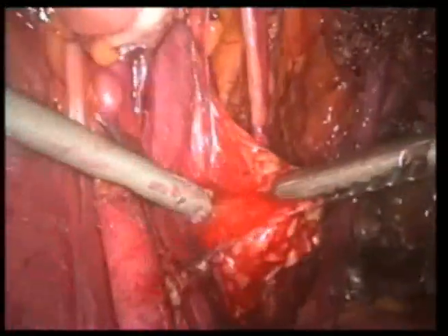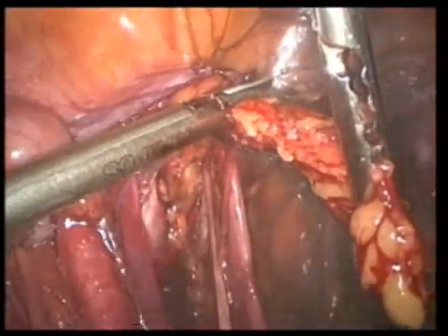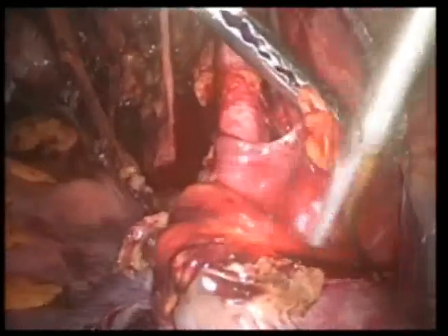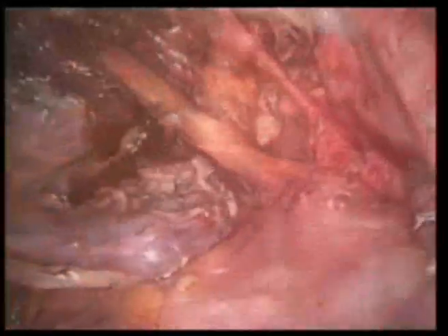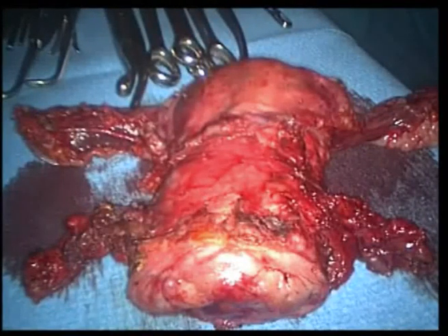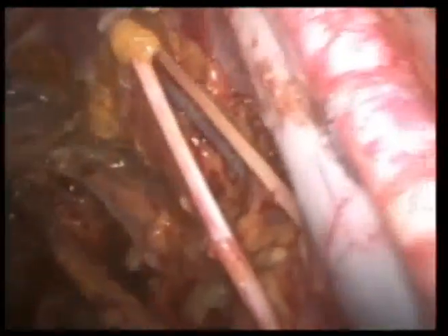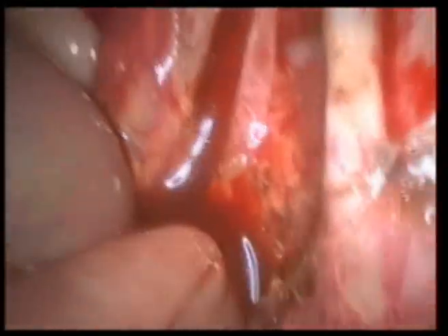Bilateral pelvic lymphadenectomy is performed, with the harmonic shears implemented for this procedure. The right pelvic sidewall upon completion of pelvic lymphadenectomy is seen here. A sponge stick is then placed in the posterior fornix of the vagina, and posterior and anterior colpotomy are performed with the harmonic shears. The omentum is placed in an endocatch and removed through the anterior colpotomy. The specimen is removed vaginally. A reassessment of the intra-abdominal cavity shows good hemostasis. An overview of all of the anatomy, particularly the periaortic region with periaortic lymphadenectomy above the IMA, is well seen here.